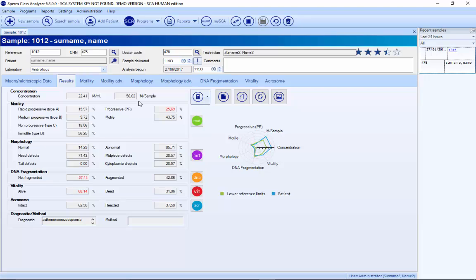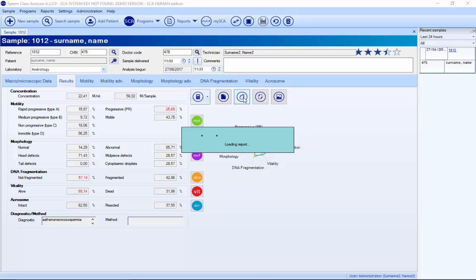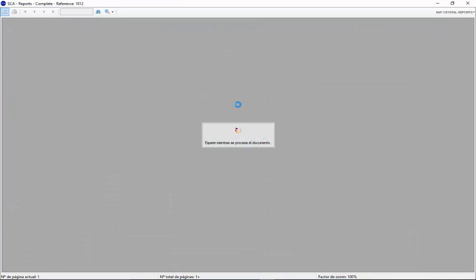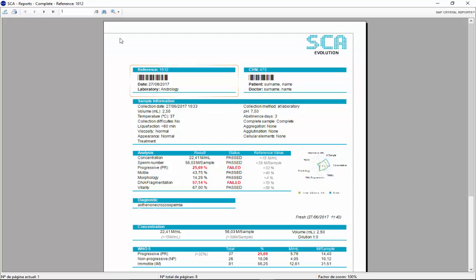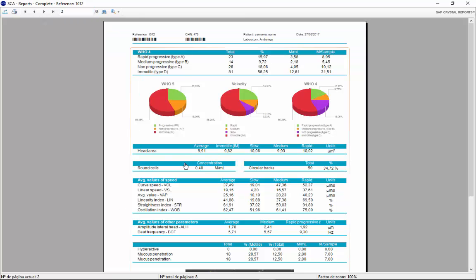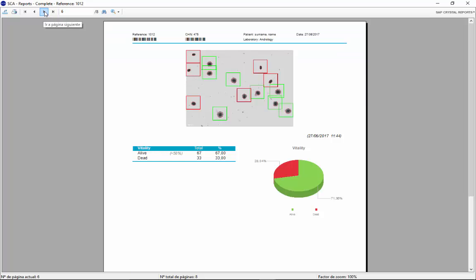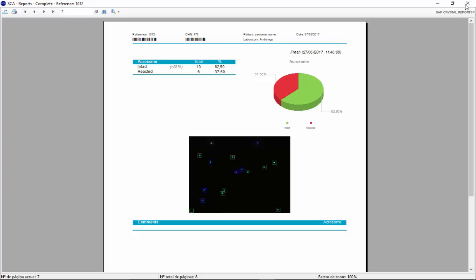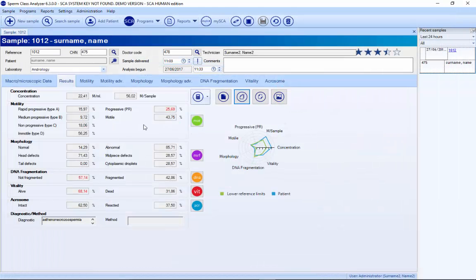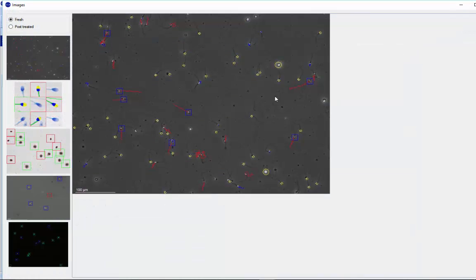Finally, here we have all the results of the sample. In this version, it's possible to have different reports: a summary report and a complete report. The complete report has everything — with images, graphics — and it's possible to customize it. All images are also saved in the database.